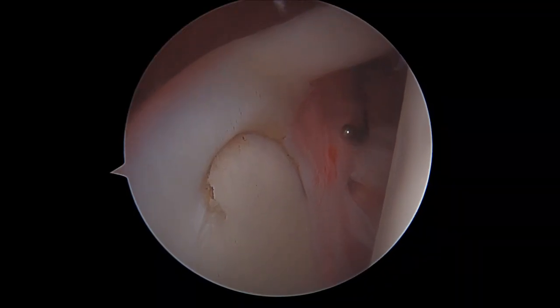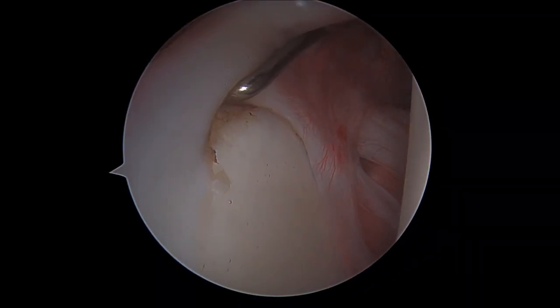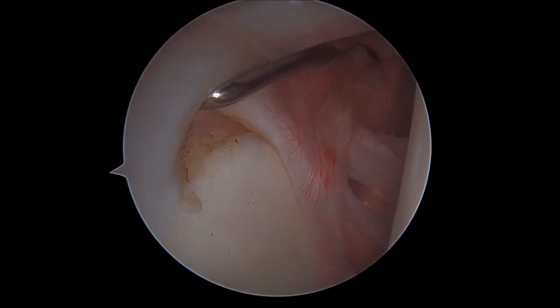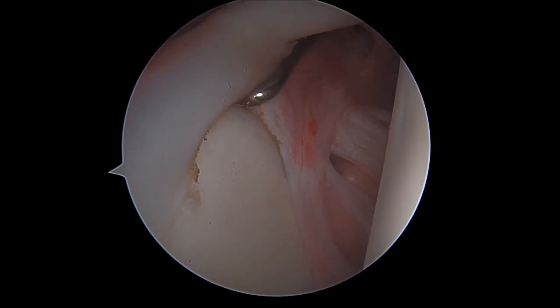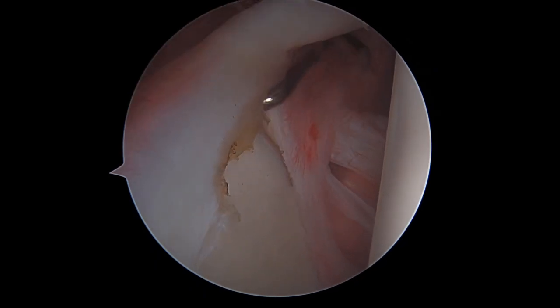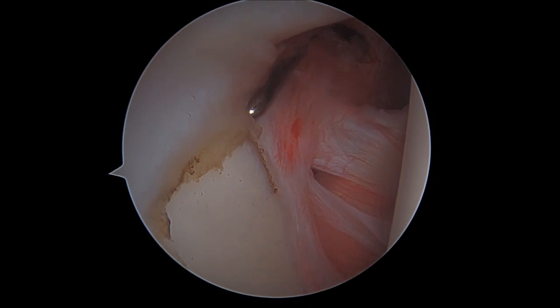The first thing we do in this case is to introduce our metallic probe in order to assess the lesion. We see a SLAP tear of type II in this case, because we have a detaching with instability of the upper region of the labrum and insertion of the long head of biceps, without a direct involvement of the long head of biceps in the tear.